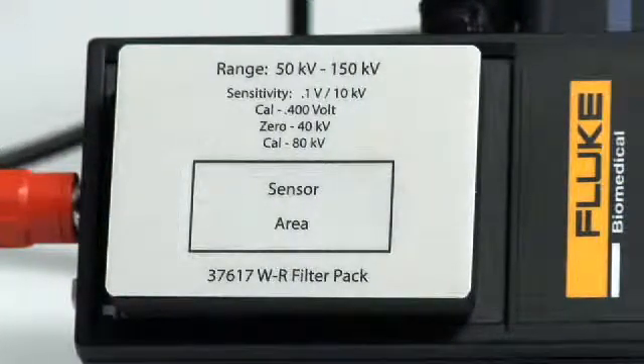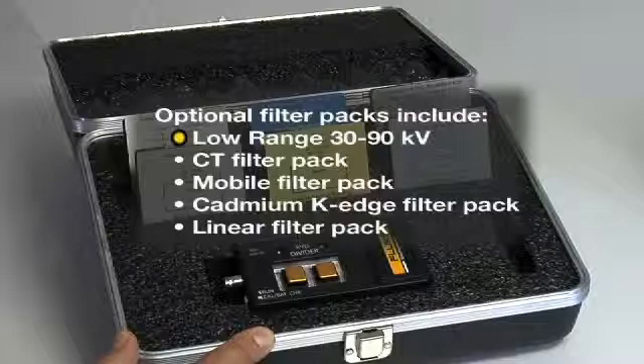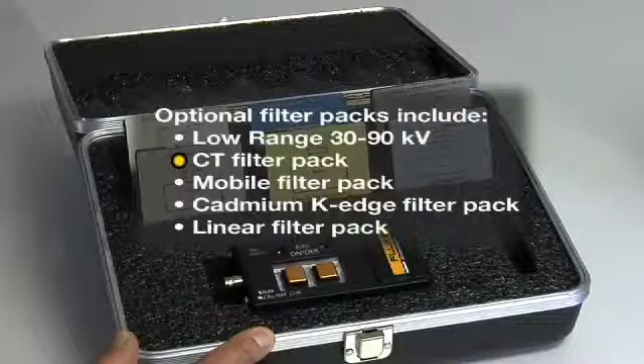The 35080M includes the most commonly used wide-range filter pack, 50 to 150 KV, as standard equipment. Optional filter packs include the low-range, optimized for measurements between 30 and 90 KV, a specialized mobile filter pack designed especially for mid- and high-frequency mobile X-ray systems, and the cadmium K-edge and linear filter pack set for use with mammography systems.